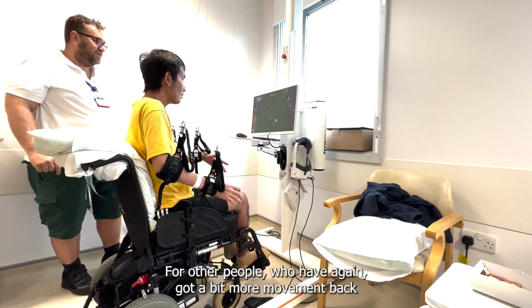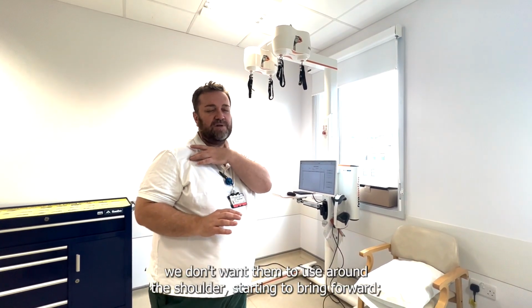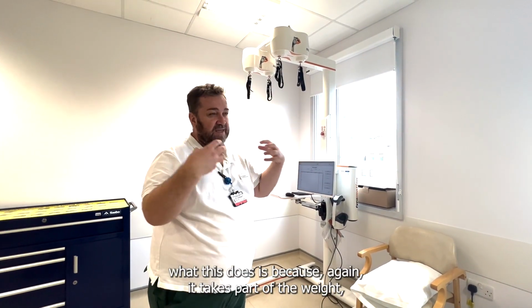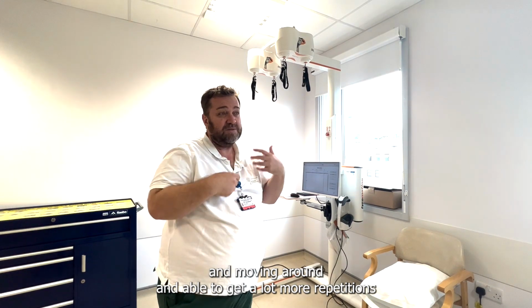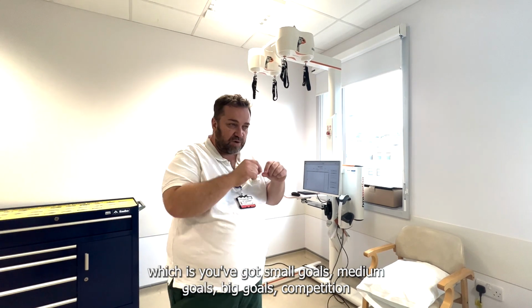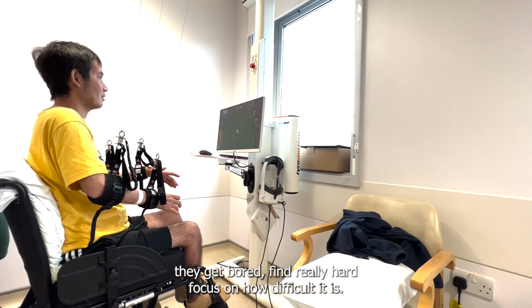For other people who've again got a bit more movement back, what we find is often a few times after they reach, they'll start to get very tired, or they'll start to use muscles we don't want them to use around their shoulder, start to bring forward. What this does is, because again it takes part of the weight, enables them to access that nice movement that we want from the shoulder, and moving around, and able to get a lot more repetitions, mixed in with the principles of game theory, which is you've got small goals, medium goals, big goals, competition against yourself or against the time, speed.